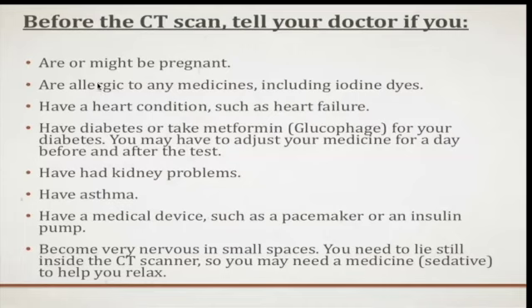So if a patient is about to go into the CT, we will ask them to tell us if they are pregnant, if they are allergic, especially to iodine dyes, if they have any heart condition such as heart failure, because this is all revolving around the ability to excrete the contrast. In the case of heart failure, we are concerned with lying supine, as people tend to lie in a CT scan. If the patient has diabetes, if they're taking metformin, because metformin interferes with the kidney excretion. If the patient has any kidney problem, if they have asthma, if they are using any medical devices, such as a pacemaker or an insulin pump, because that might interfere with the imaging.